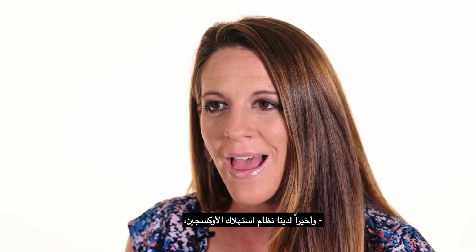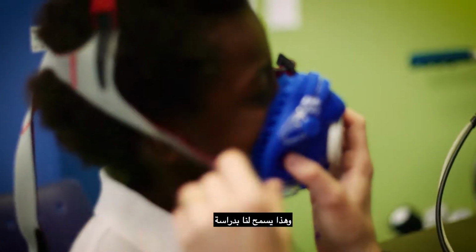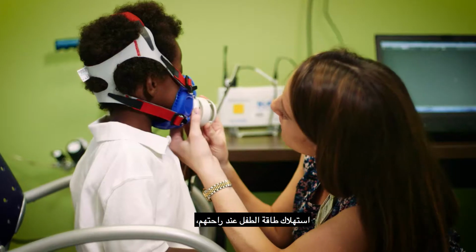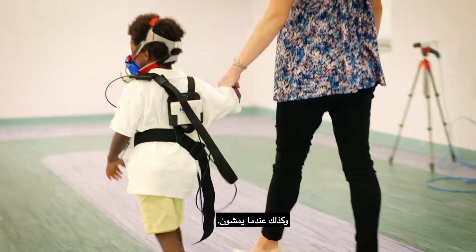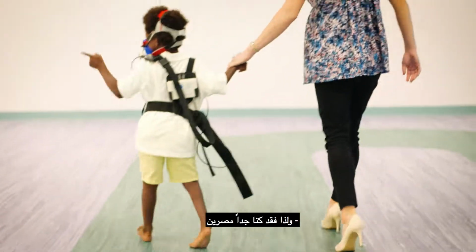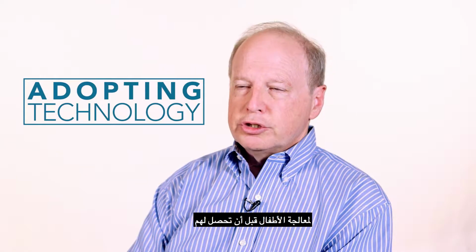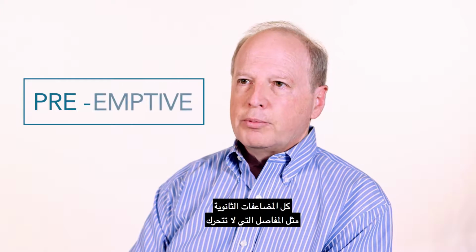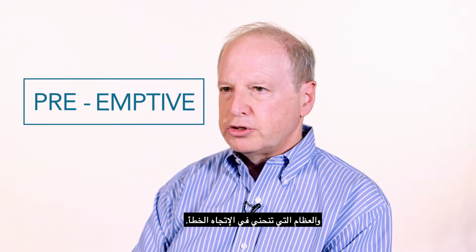And then finally we have the oxygen consumption system. What that allows us to do is to study a child's energy consumption while they're resting, as well as while they're walking. And so we've been very aggressive about adopting this technology and using it to treat children before they develop all the secondary complications like joints that won't move and bones that are bent in the wrong direction.